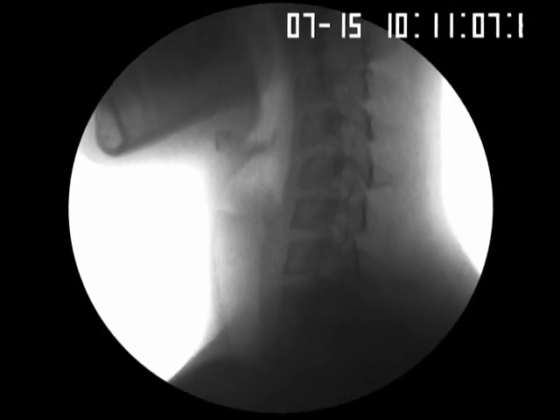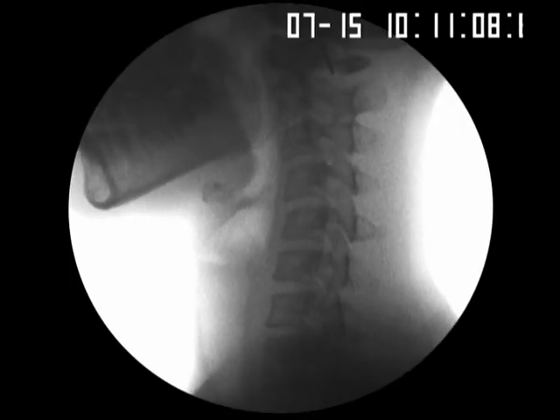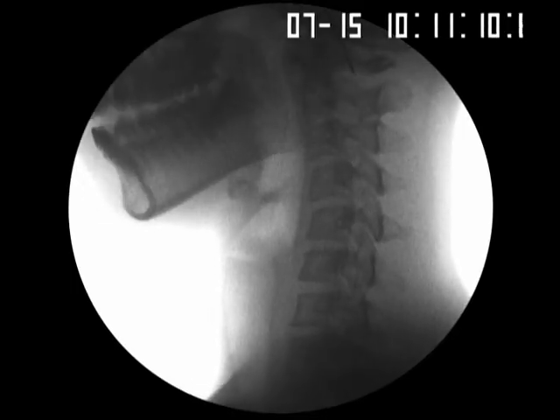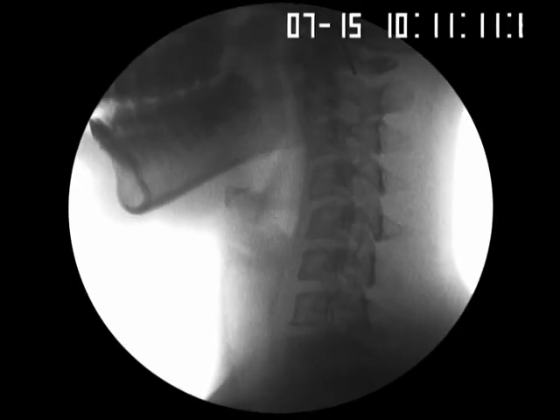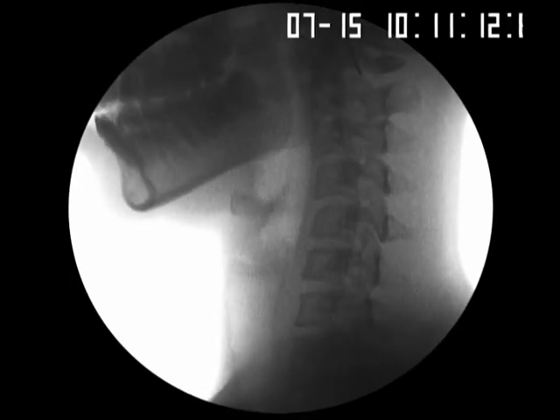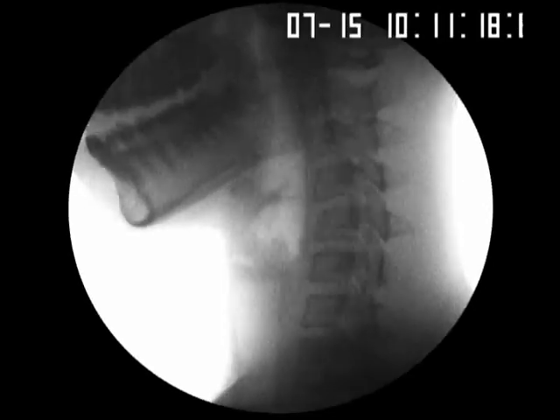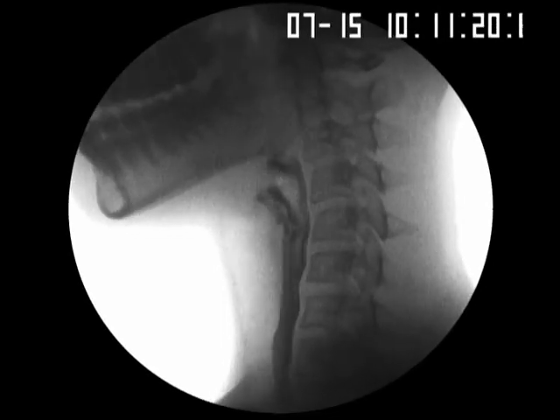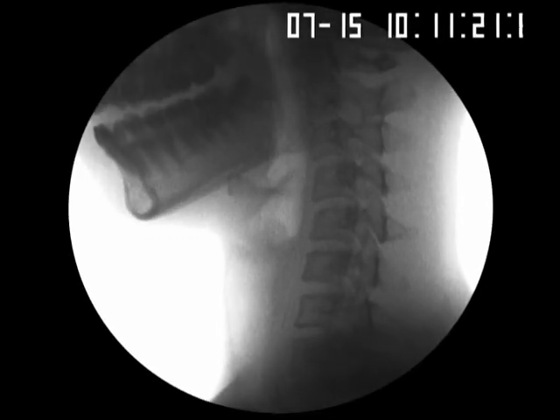Okay, I just want you to look straight ahead at the wall and say candy, candy, candy. Great. I'm going to give you the cup. This is a barium liquid. I just want you to take one sip and swallow.